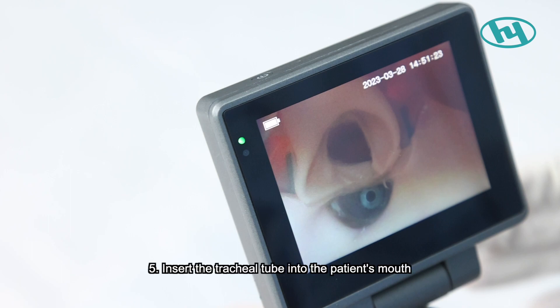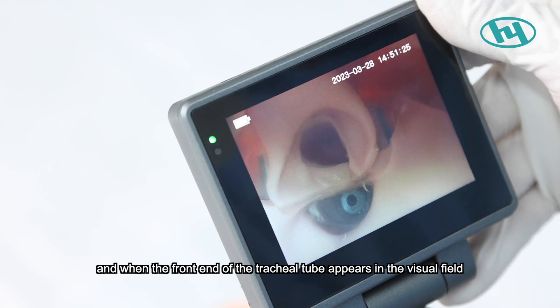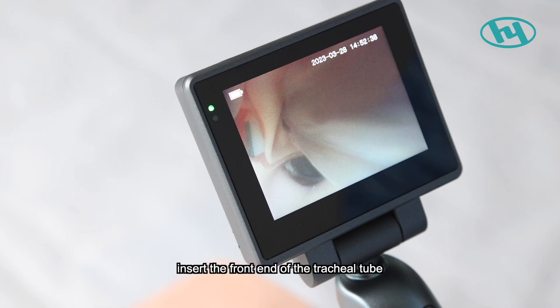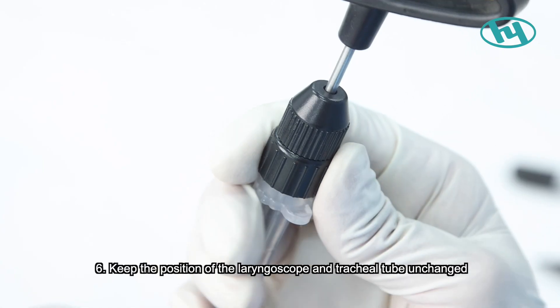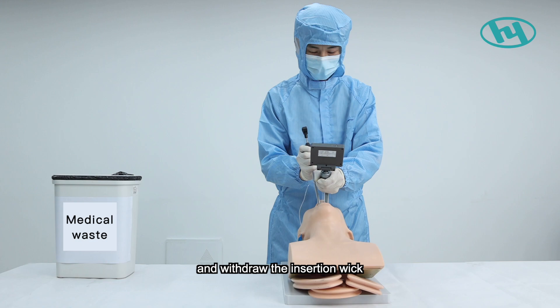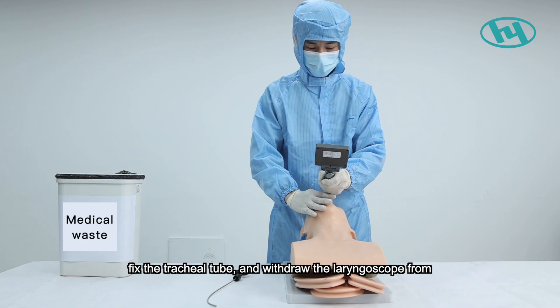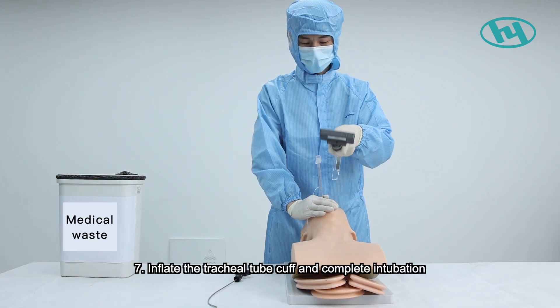Step five, insert the tracheal tube into the patient's mouth along the right side of the blade. When the front end of the tracheal tube appears in the visual field, insert it against the vocal fold to the appropriate depth. Step six, keep the laryngoscope and tracheal tube in position, withdraw the insertion stylet, fix the tracheal tube, and withdraw the laryngoscope from the oral cavity.